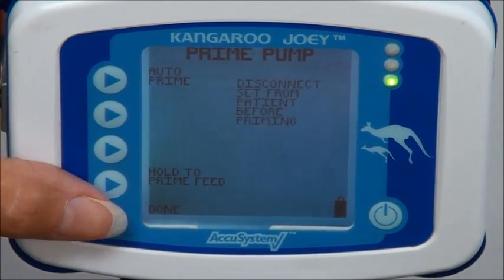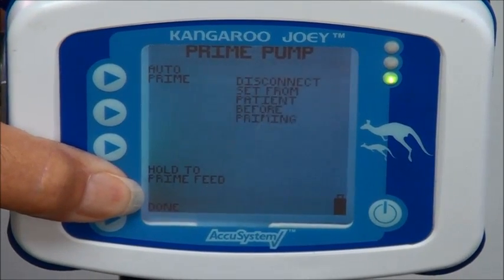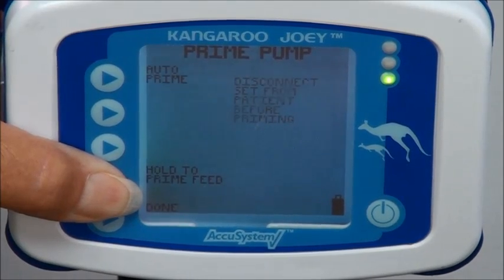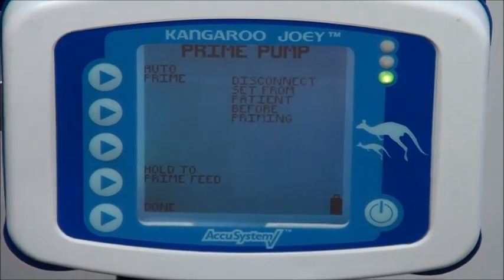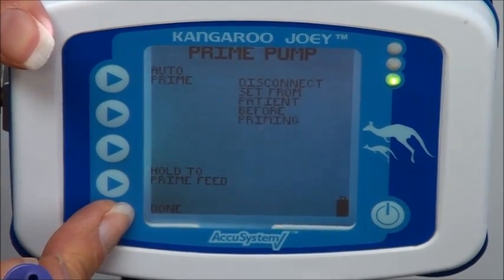And then you're going to come down to where it says hold to prime and you're going to hold that button in until your food comes all the way to the end of the pump set. That way you can make sure that you don't have any air bubbles in your line. And then when you're all done priming, you're going to push the button down at the bottom where it says done.